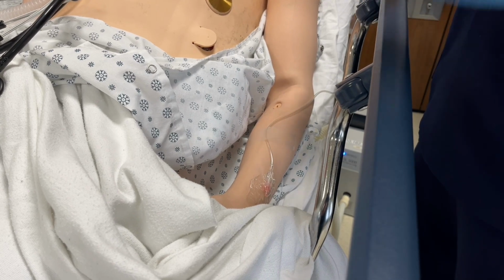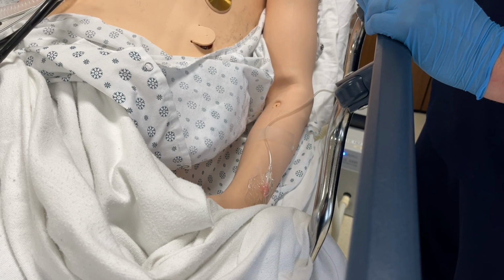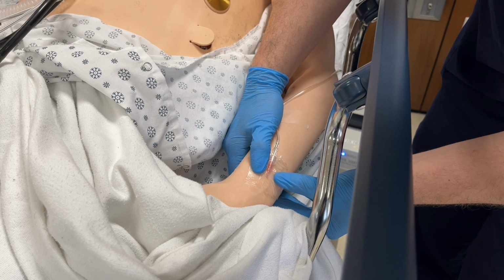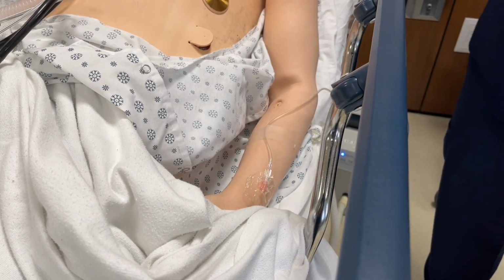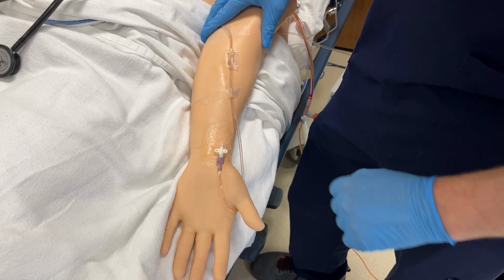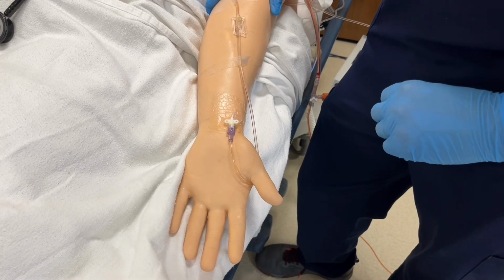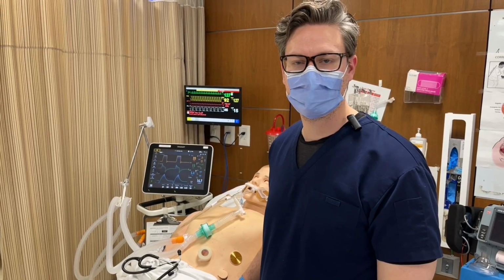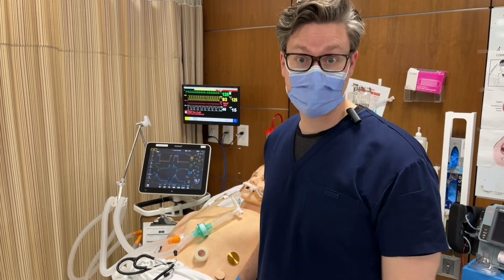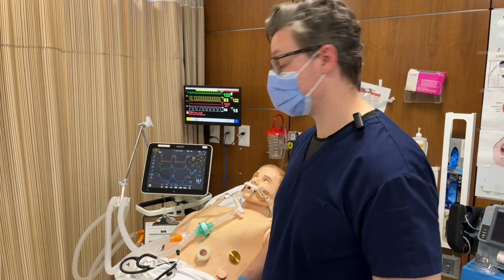If the patient has any lines in for medications, fluids, or to monitor things like blood pressure, we want to inspect the insertion to ensure there's no irritation. If the patient has an arterial line in, inspect the insertion site for any irritation. Was there any irritation at the arterial line site? Do you have a proper waveform on your monitor?